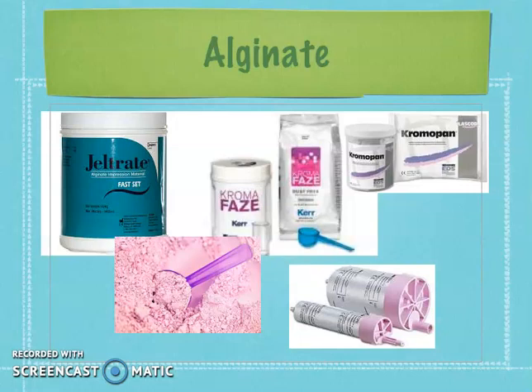So lastly, this is just a slide that I added, some things that may not be in your textbook. This is just fast set. I just wanted to show you where to look on the can. It can say regular or normal set. This is fast set. Typically alginate is white, but it can come in color. So this is a pink fast set alginate. This is chromophase.